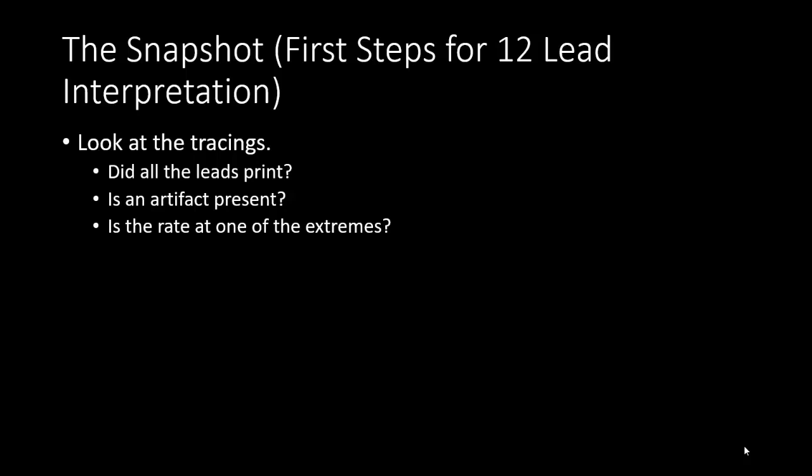Also, look at your rate. Is it at one of the extremes? Is it too fast, too slow? Because that could also be an indication of an inappropriate print off.